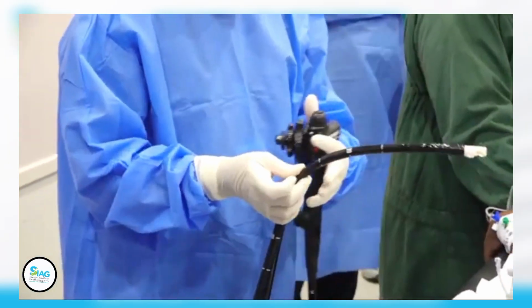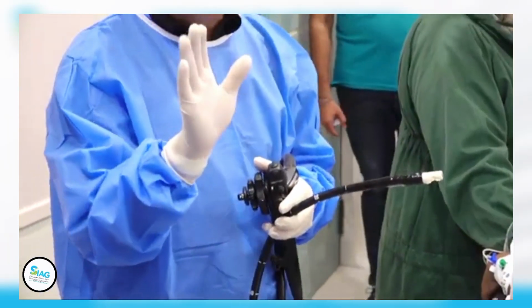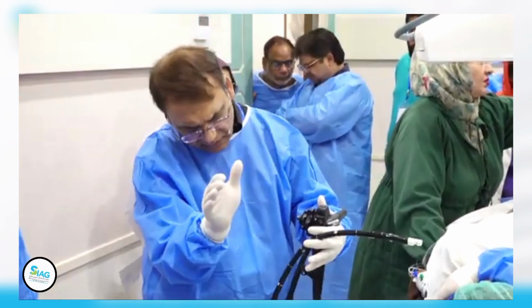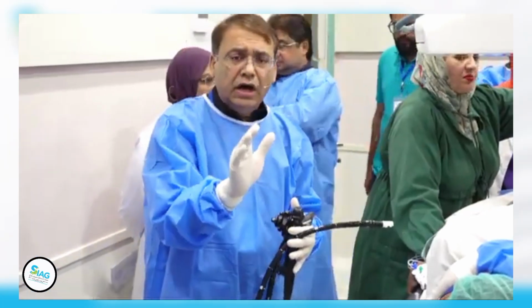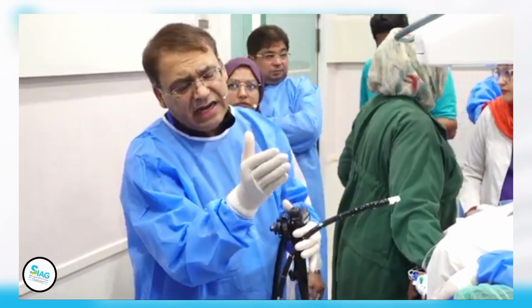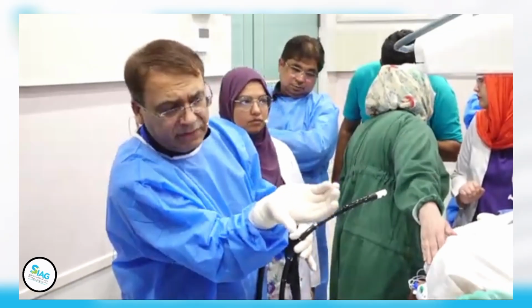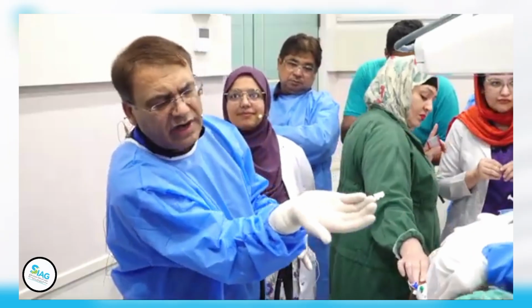The way I intubate the upper esophageal sphincter: usually people go over the tongue like that, which is totally fine. Whatever works for you. But the way I do it is I kind of make an oral airway. I flip the scope, bend it a little bit, flip the end of the scope, and go over the tongue. That helps me get over the tongue without any problem.